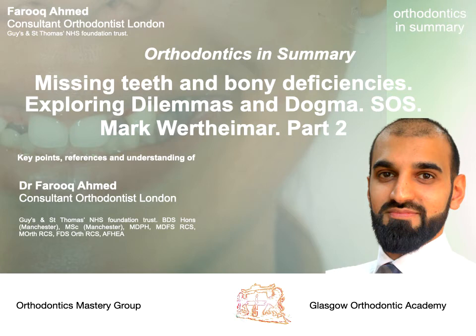So the idea was then taken forwards, and placing a miniscrew and attaching a prosthesis to it was followed up for 5 years by the Carolantini group in 2017, and it showed that the prosthesis of the lateral incisor remained and the miniscrew stayed in situ with that bone also maintained. But not only was the bone maintained, actually the bony development vertically continued as it did in the adjacent sites where the other teeth were.